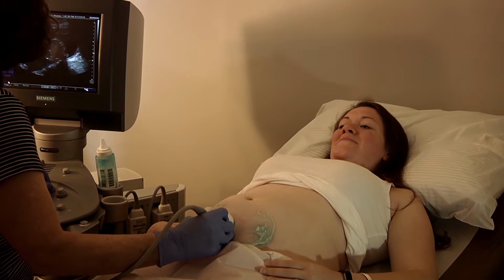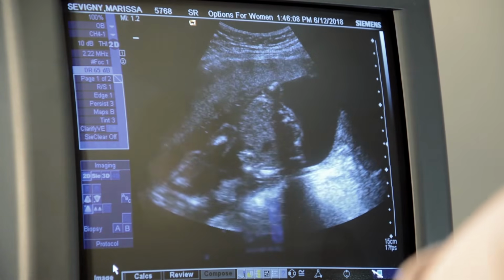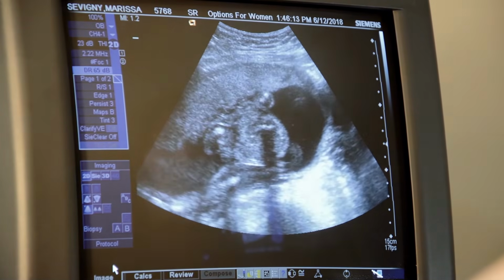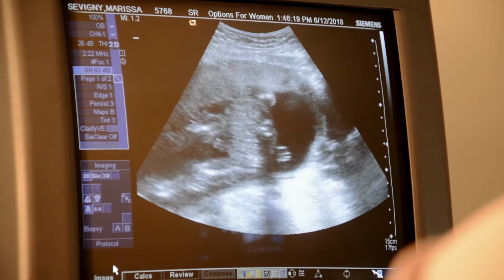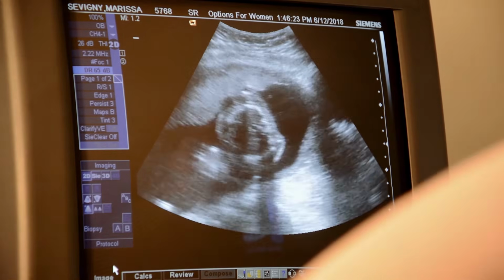Okay, so looking at this picture, what can we do to improve it? Lighten it up, right? So what button would that be if we're going to lighten that up? Is that 2D? No. Gain. She's figured it out. Okay. Good. Yes.